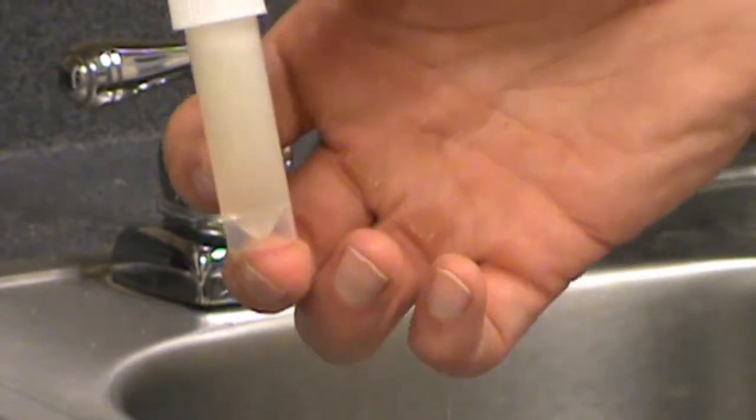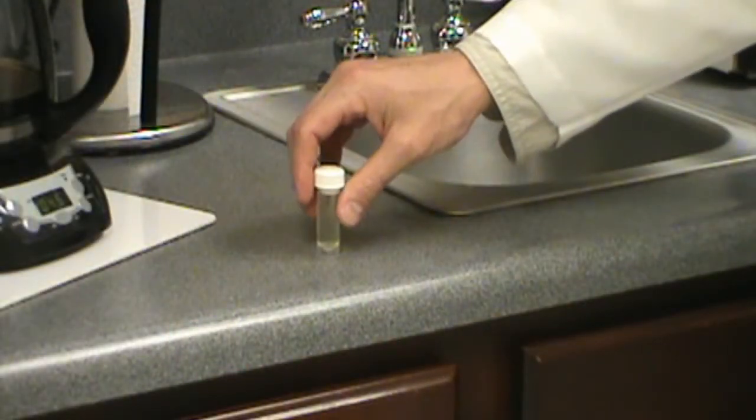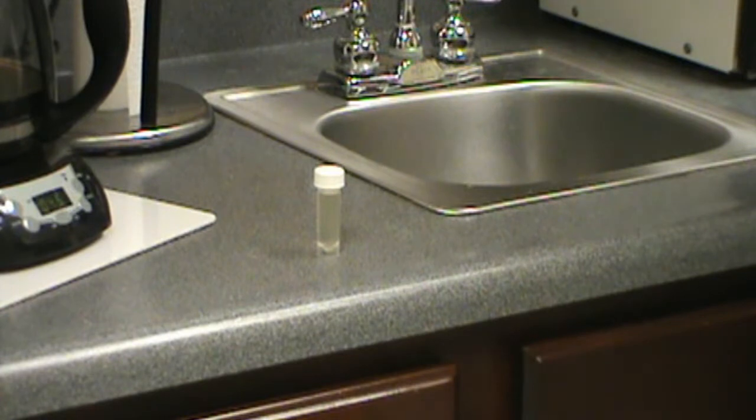The bacteria you're testing for incubates best between 70 degrees and 100 degrees Fahrenheit. If you're in a climate controlled environment, simply place the vial on a countertop in an upright position, out of direct sunlight, and out of the reach of small children.